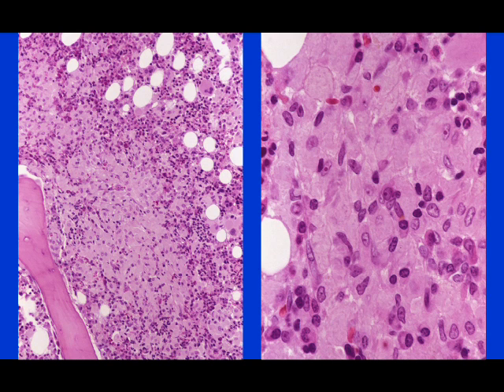So we did a trephine biopsy, and at first glance thought, is this histiocyte proliferation? Could this be Gaucher's? Well, we also learned during the course of evaluation of this patient that he had not only blood cytopenias, but had a very low CD4 count. He was tested for HIV and was positive.